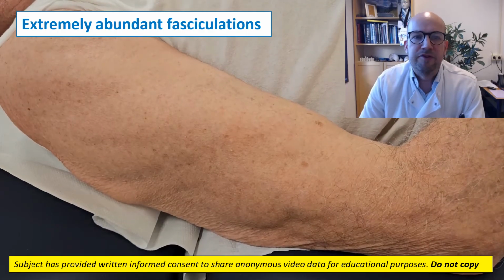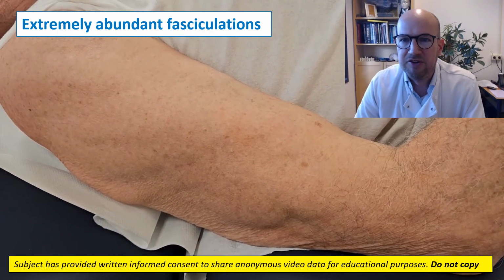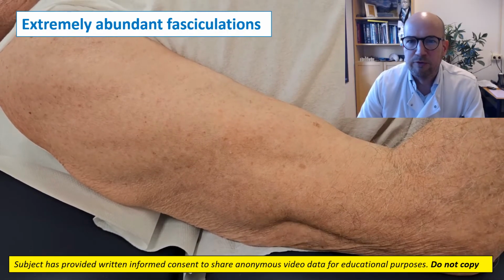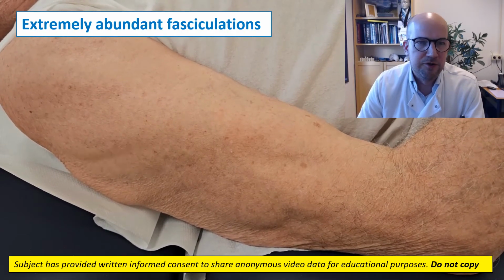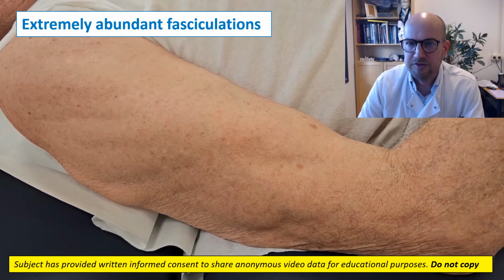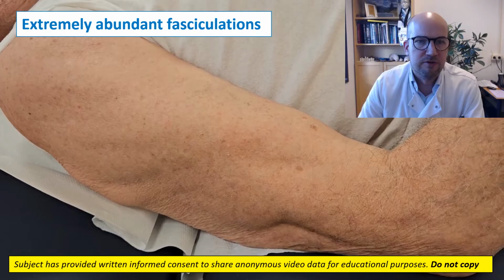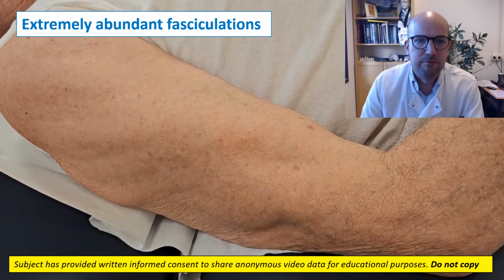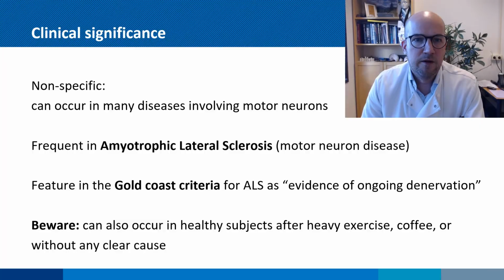In this example, fasciculations are extremely abundant and can be seen in several muscles of the upper arm. They're easier to see because they appear more frequently, but in this case the motor units are probably also enlarged due to a neurodegenerative process. This means that a larger number of muscle fibers are contracting simultaneously, leading to a more pronounced, more visible movement.